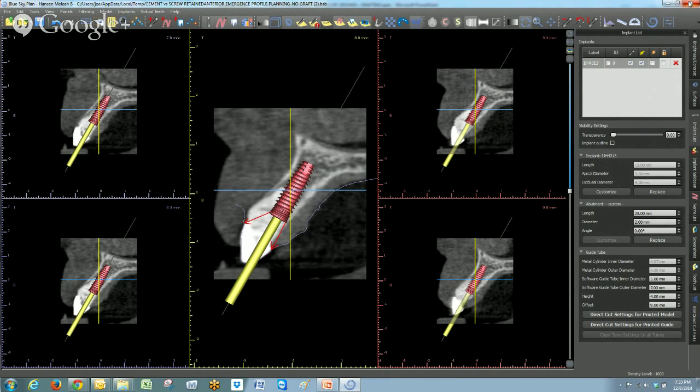Everything's digital. So we're going to show in the last lecture a lot of what we can do with scans from all the various scanning machines that allow you to send STLs of scanned arches to us. So I don't have that in this one, but in January, the last one, I think it's like the second or third week in January, that's what we're going to present. And it'll be a wealth of information about that.